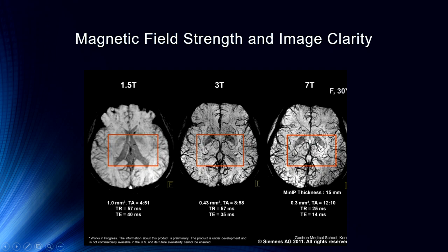So the 7T magnet is going to require quite the facility. There is actually a new magnet under development at the Neuro Spin Center outside Paris, which is 11.75 Teslas, and it weighs 132 tons.